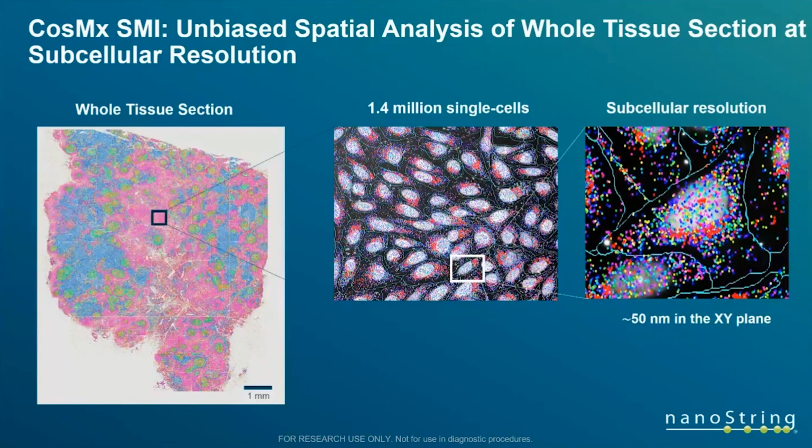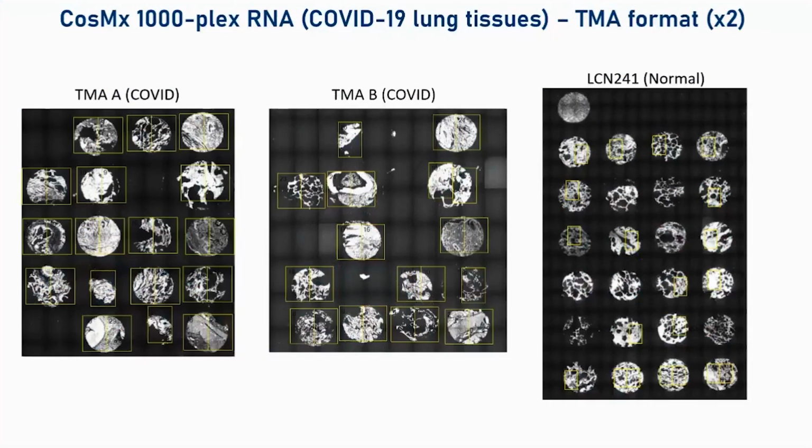And so we used this NanoString spatial molecular imager, which allows you to do single cell and subcellular profiling of the tissue. And we ran 1,000-plex RNA single cell readout on an independent cohort of tissues. This was collected across 40 additional autopsy studies of lungs taken from COVID-19 patients, and we made a tissue microarray of it. And the fields of view that were used to capture these areas is shown in the yellow boxes. So we had COVID TMA-A, COVID TMA-B, and a normal control that we used to contrast this data to.